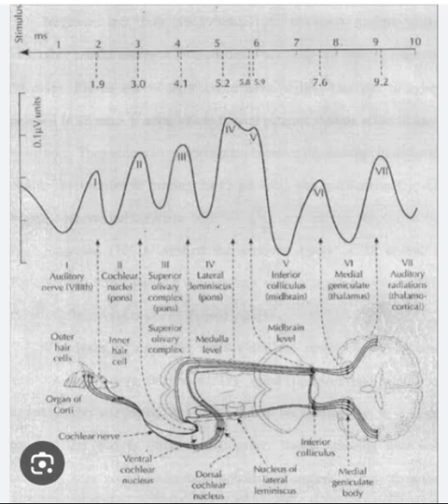By comparing these ratios, it is possible to assess the symmetry of the auditory pathway and identify any interaural differences in the wave amplitudes. Significant differences in waveform ratios between the two sides can indicate abnormalities or imbalances in the auditory system, helping to localize potential pathology or dysfunction. Comparing same wave ratios across each side provides valuable information for diagnostic evaluation and treatment planning in BERA testing.